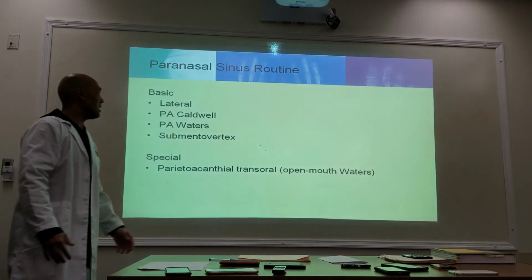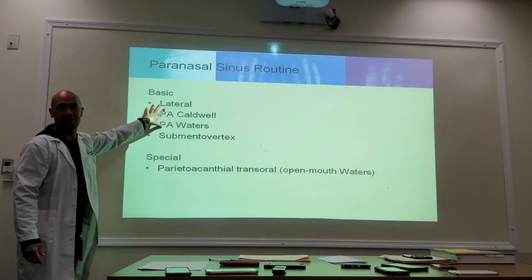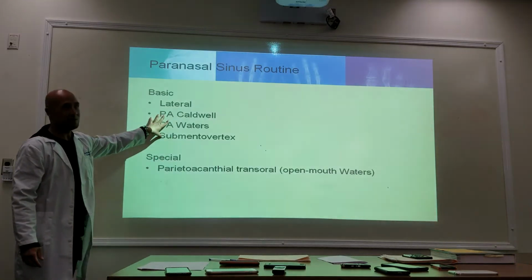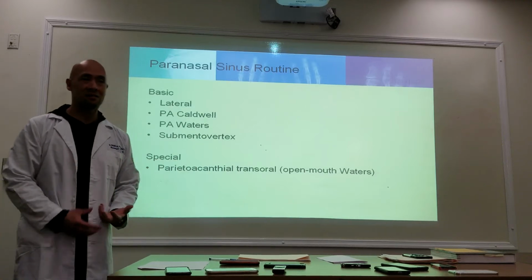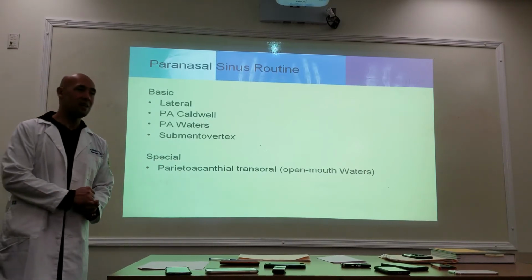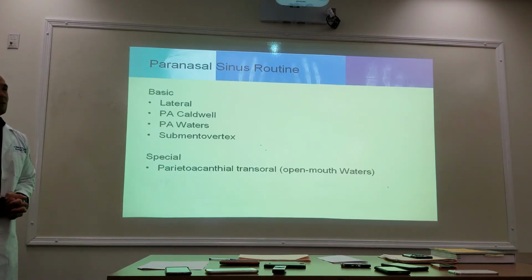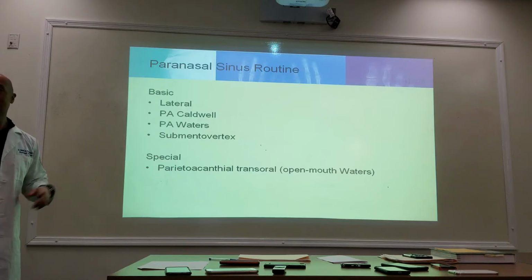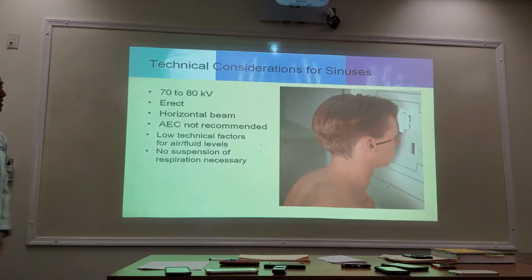Paranasal sinus routine. Okay. Same views as what? Same views as the skull. The only difference here is we're looking at sinuses. So if we're looking at air-filled sinuses, what do you think our technical factors are going to be? Low, right? These are all the exact same positions. So here is the OML perpendicular. Okay, oh, I'm sorry, technical considerations.